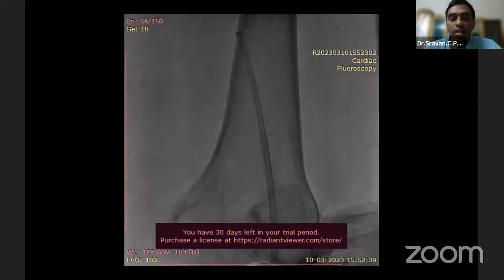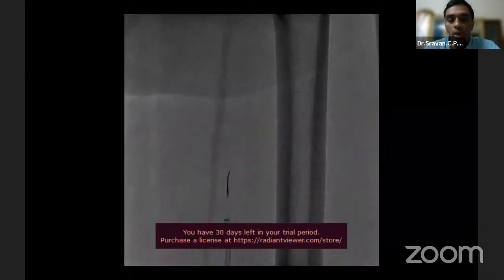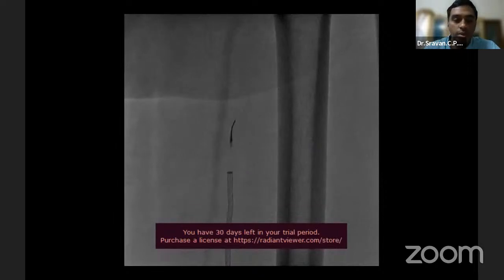So this is a CAT8 X-Torque connected to our second generation Penumbra pump. Gradually from each segment, the acute component was sucked out. So clearing the popliteal vein, then the superficial femoral vein, also taking the separator, which helps in two things. One, to declog the CAT8 catheter, and also to break up a big clot which is stuck to the catheter tip, so that there's a continuous aspiration going on, instead of the catheter being stuck and forcing us to remove the catheter, flush it, and reintroduce it again. The video is in kind of 2x or 3x, that way it looks like that.